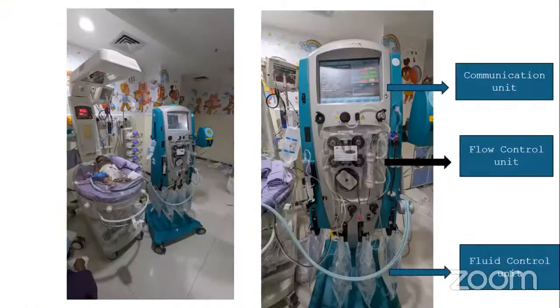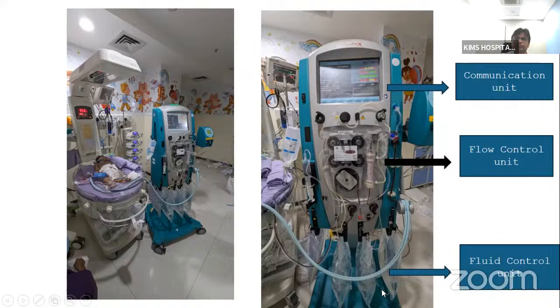Now we'll see briefly how this machine works. This was the first case we started CRRT in our unit, a neonate of around 3 kg weight. This machine has three parts: a communication unit, a flow control unit, and a fluid control unit. In the fluid control unit, we can see four bags: an effluent bag, the PBP bag, the dialysate bag, and the replacement fluid bag. We'll come to details regarding the machine in later slides, and I will explain how the blood flows through this CRRT machine through this video.